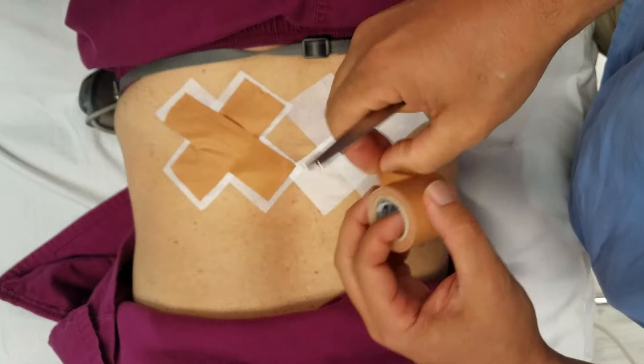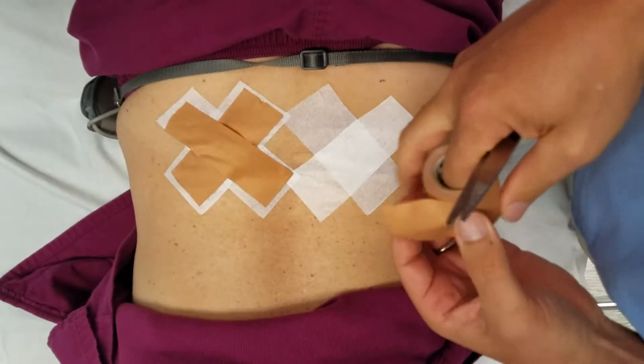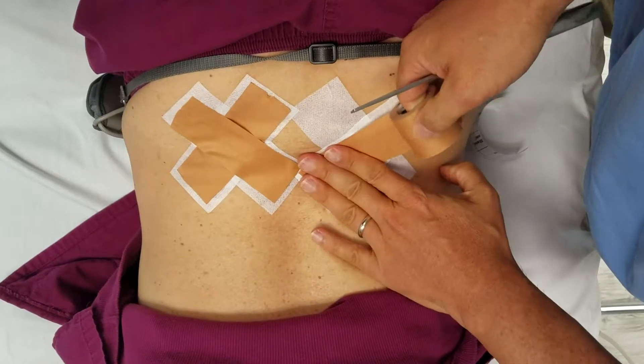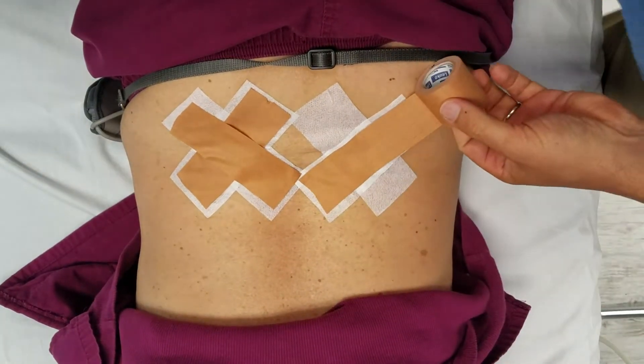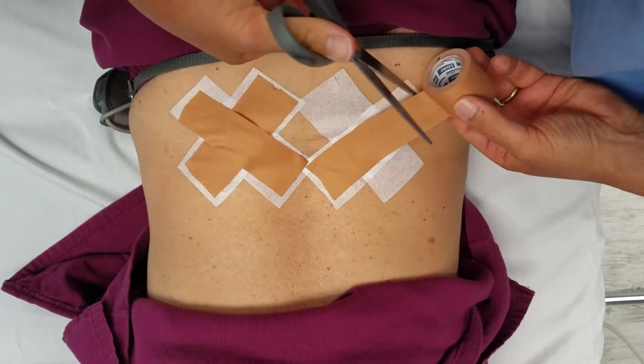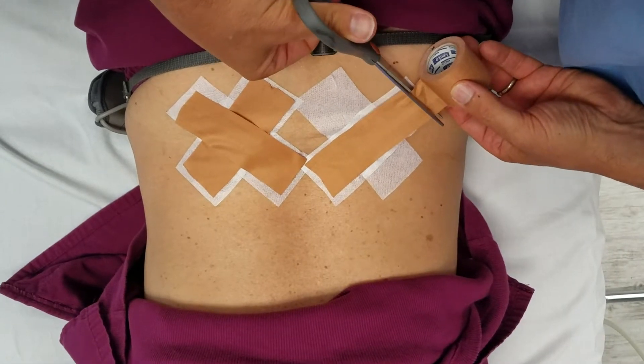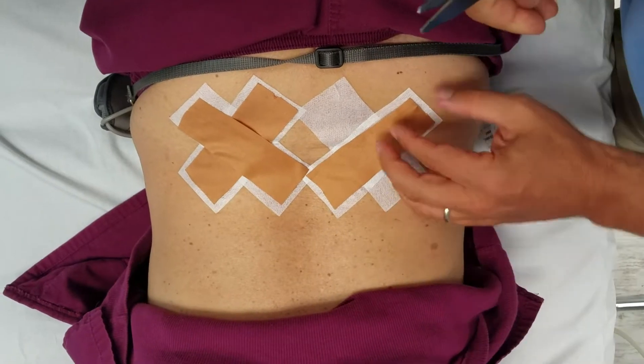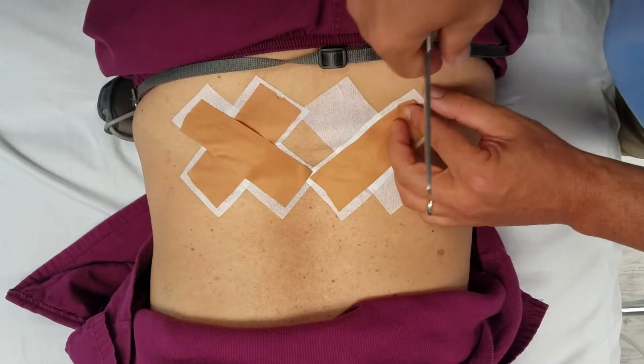It lasts about one week each time we put it on. For each application, we expect it to last for an entire week. If it comes off, put it back on — but don't take it off and put it back on each day. The reason we don't is because it tends to irritate the skin. Once a week, the skin won't be irritated.